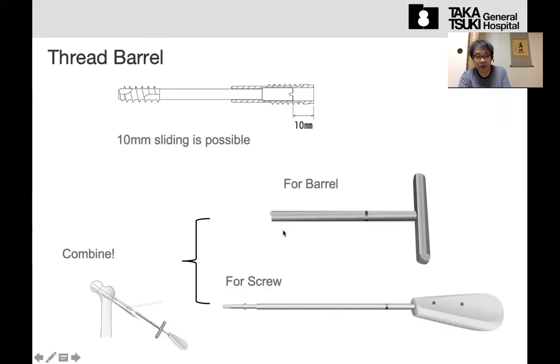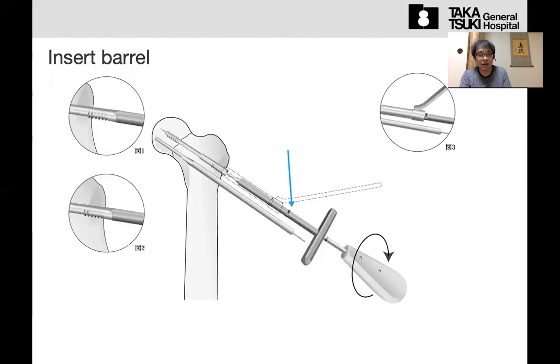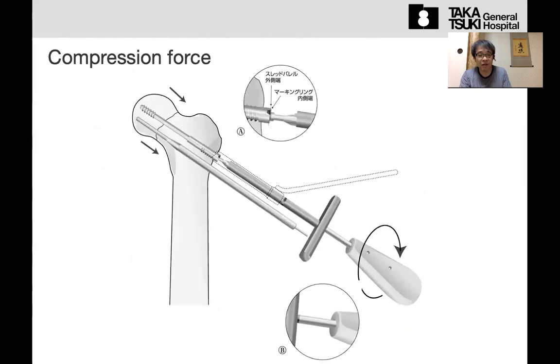This is for the screw, and this is for the barrel. Insert and rotate the two drivers simultaneously. They insert the screw and at the same time insert the barrel, twisting the largest driver. Avoid interference between the two; they should be rotated simultaneously. Then insert the barrel, and then compression.